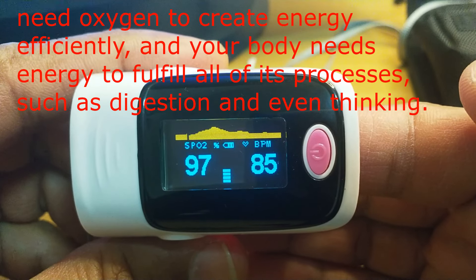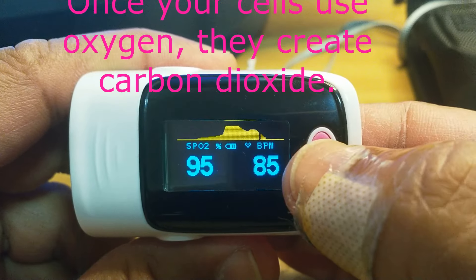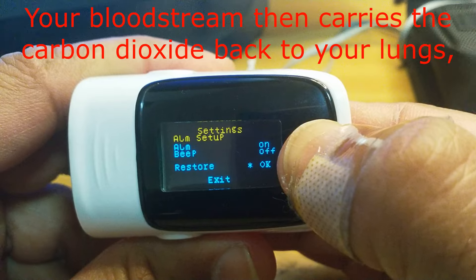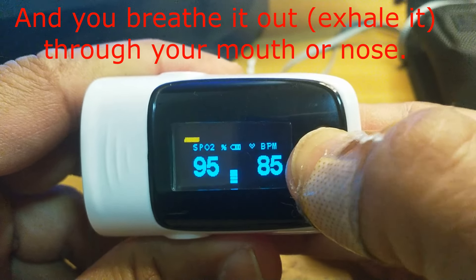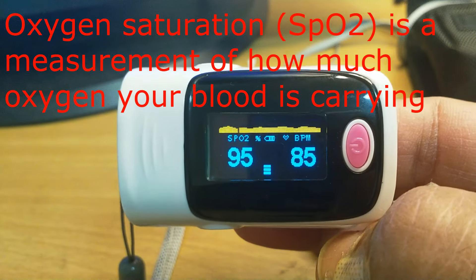Beep is on — press once to exit, or continuously press to continue. Now with each pulse it will give a sound. To reset, I will go to restore with a continuous press. You can see the alarm is on and beep is off. Then exit — continuous press to exit. Now there is no sound.